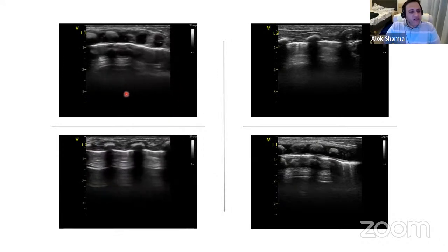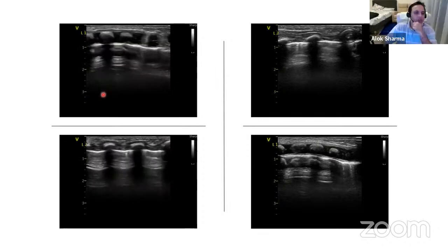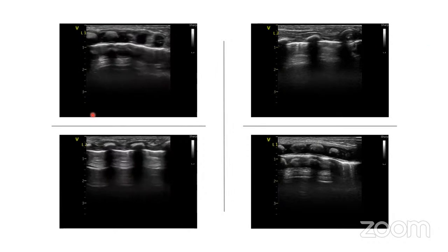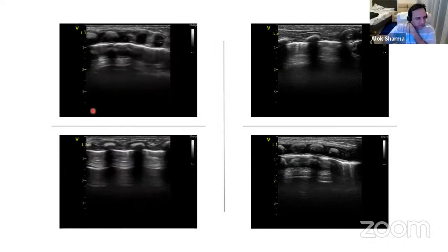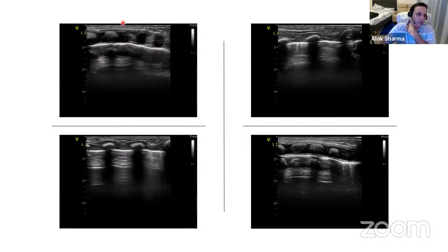Do you want to criticize it a little bit? Yeah, first, the depth is only three ribs, I would go to four maybe. Beautiful. And then you don't see the B lines to the end, so maybe here I will decrease the frequency. So what I'd say is that if you want more depth at this particular point, then your frequency would have to change. You're absolutely right. Okay. What about L2?